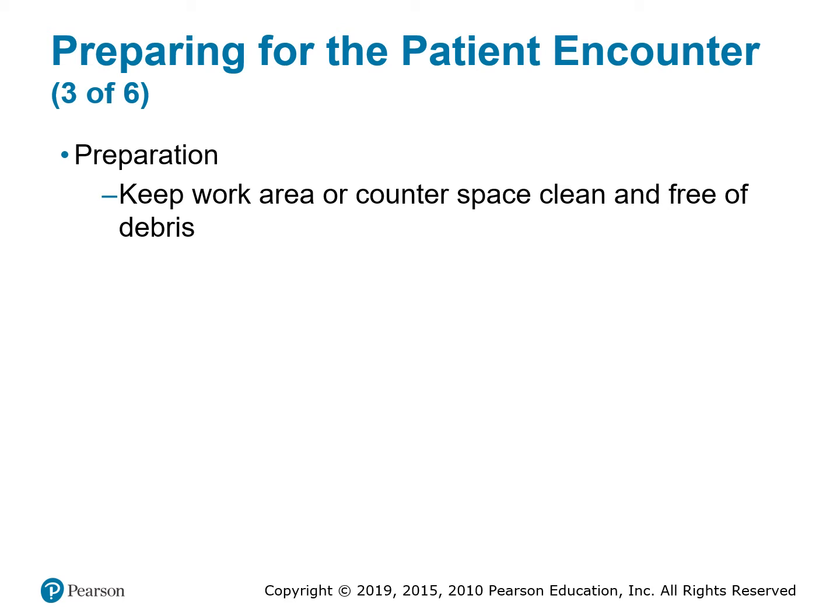Yes, you are sometimes carrying 5 or 6 patients' different labels. Paper clip them together. Like, this is Mr. Brown's test. This is Miss Suzanne's test. This is Miss Joellen's test. If they have more than one label, paper clip those labels together. Just don't stack them all in one big clump and then have to fish through to find what other tests this patient had. That's when mistakes start to occur, because then you have missed tests since you don't know where his other label is. Before you start your day, put all labels together. Paperclip them together: same patient, different tests. Keep yourself clutter free and organized. Become OCD.